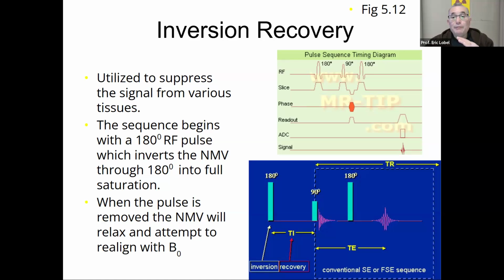And then, before it gets a chance to recover, it's hit by other pulses. And then it keeps getting hit by other pulses. So it will just never recover. It's kind of like good luck trying to walk up an escalator going in reverse. Right? Unless you speed up, if you go at the same speed, you're just going to stay in one spot and you're just never going to make it up. So that's why you actually only have to do this once, right?